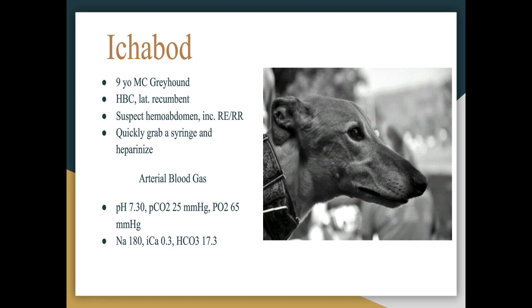Pretty clearly, the first thing that you may worry about is that your sodium is falsely elevated from using sodium heparin, and that your ionized calcium must be discarded because you cannot evaluate an ionized calcium when using sodium heparin. Only lyophilized lithium heparin can be used.